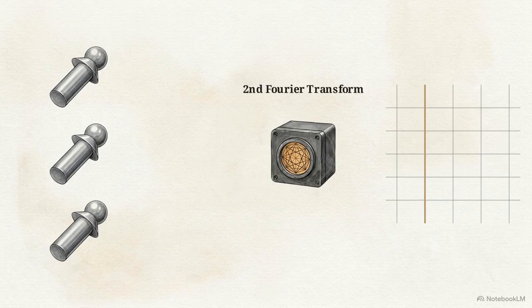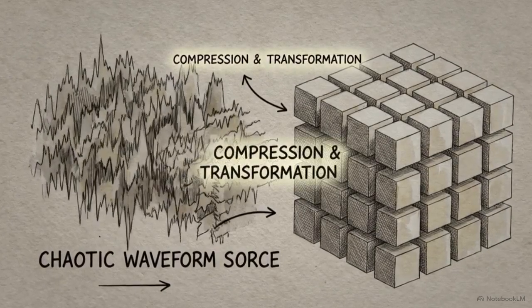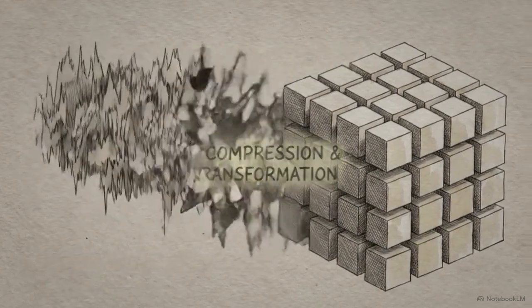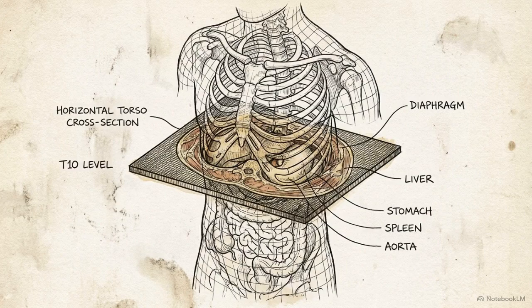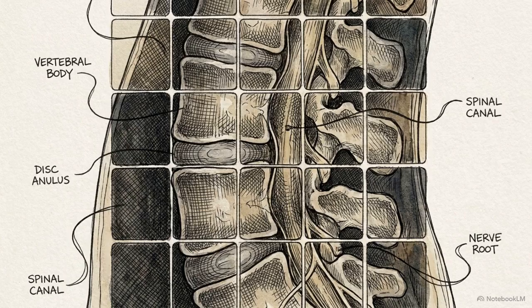We can now apply a second Fourier transform, but this time it analyzes the frequency of phase evolution across the different cycles. This extraction provides the final coordinates for the y-axis. Layering slice selection, frequency readouts, and phase shift cycles sorts the radio waves. The chaotic echo is finally forced into a perfectly readable 3D matrix. We've built the grid. The z-gradient isolates the tissue slice. The x-gradient sets the frequency columns, the y-gradient shifts the phase rows, and the Fourier transform calculates the geometry.